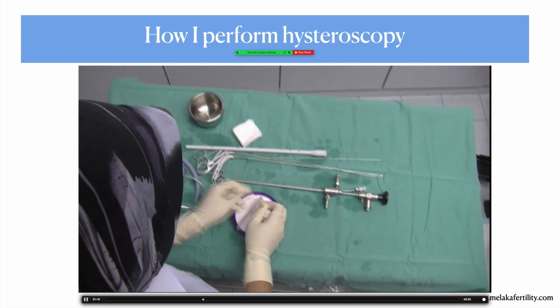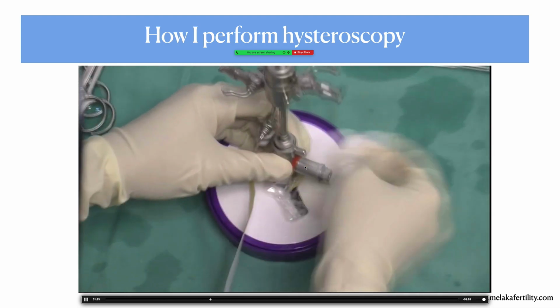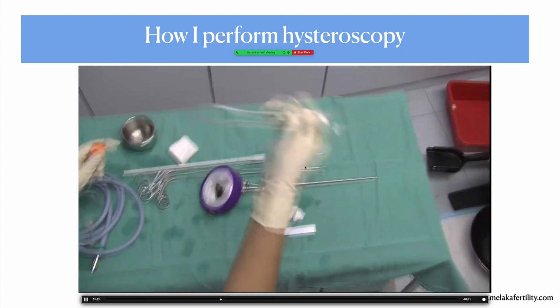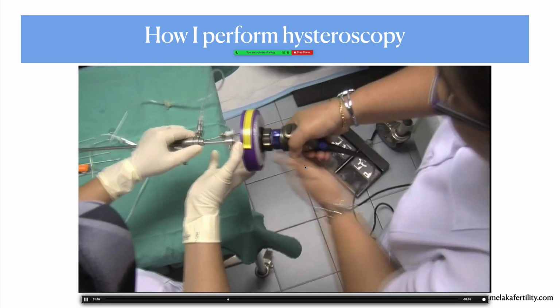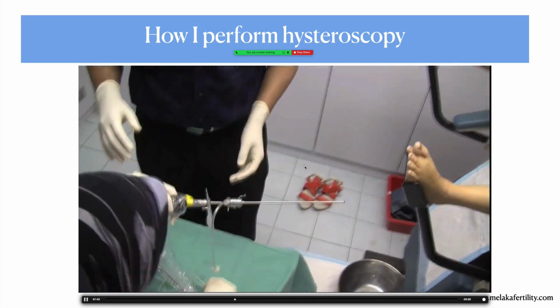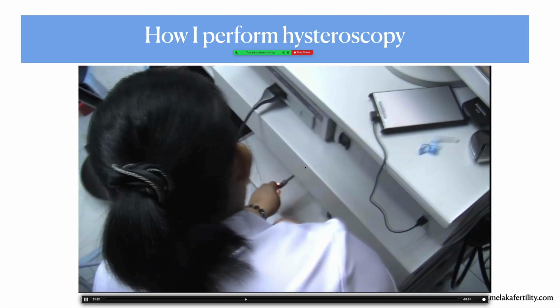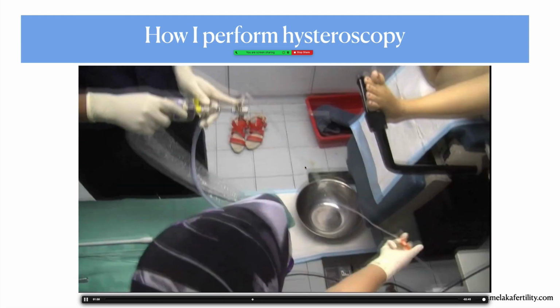In this way, we protect the instrument as well as keep everything sterile. And so this is attached, and then this is used to sleeve the camera system. I think most of you will be doing the same thing, but this is the way that I do it. And the drip set will be set up, and my other nurse will then attach the camera. The camera is not soaked, so it will be attached to this system, and I'm ready. So once they say the patient is ready, and the water is placed, I'm ready to do the scope. The light source is attached, and so I'm ready.